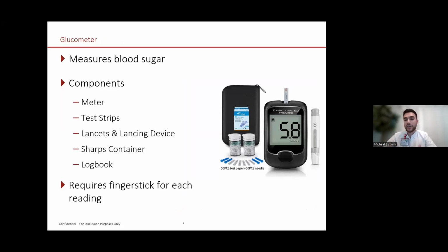So how do we obtain our reading? Traditionally, we use glucometers. We'll talk about two different devices. One is the glucometer, and the other one is the next device we'll talk about.